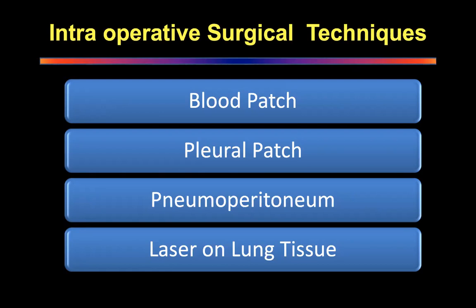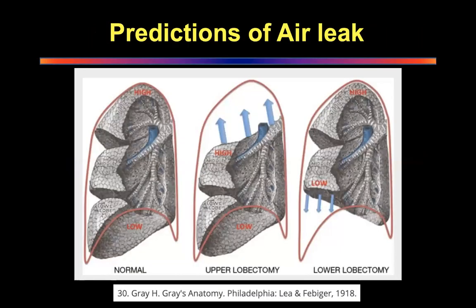So then you use a laser to cut into the tissue and take out the metastases, and then you buzz the raw surface with the laser, which has a very good ability to be pneumostatic. It actually stops air leak on the surface of the lung. I have used this many a time and I'm very happy with this technology. If you want, someday I'll show you how lasers work.